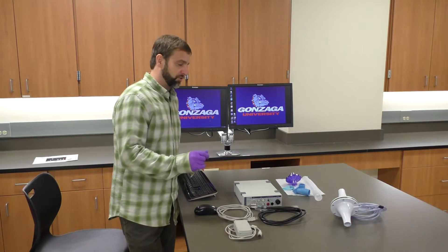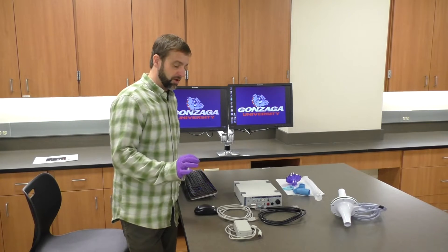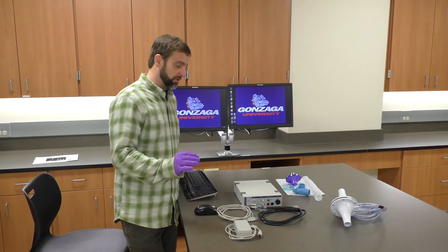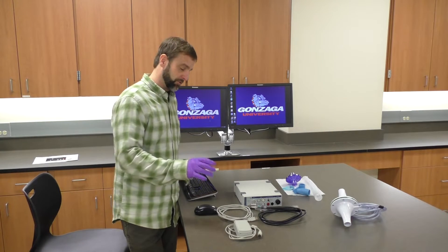Today we are going to do one of our most complicated setups for PowerLab. There are a number of steps and some important instructions to follow, so as long as you follow the instructions, you'll be okay.